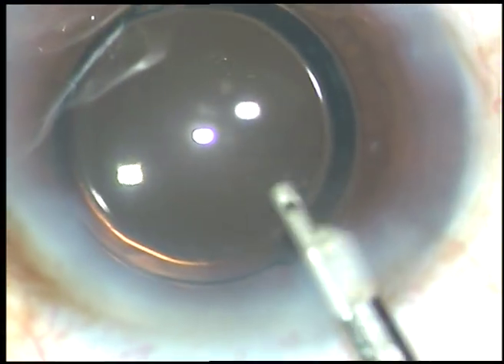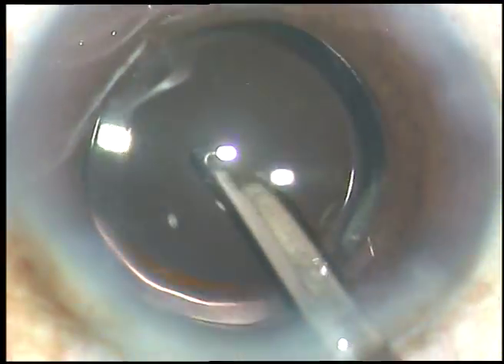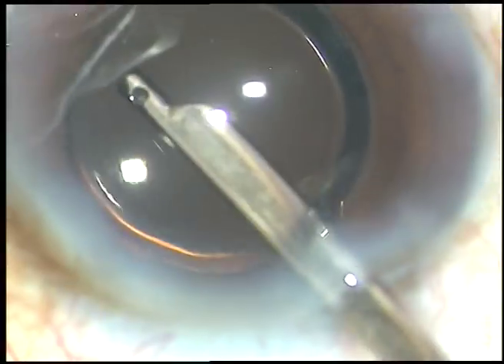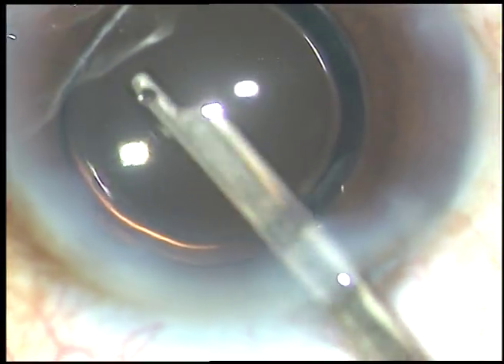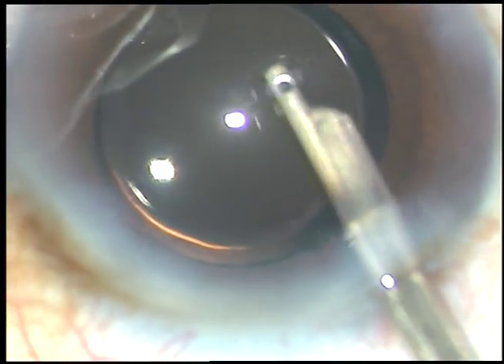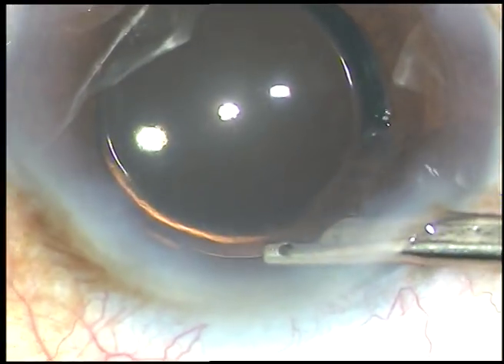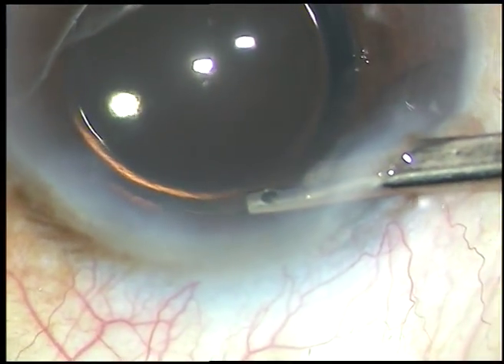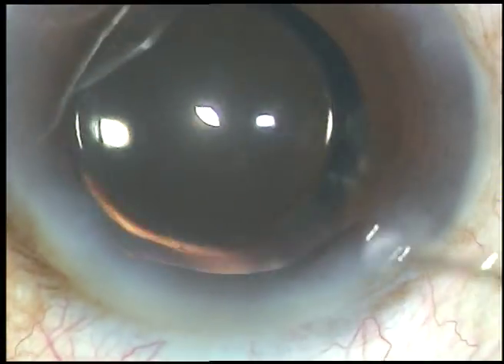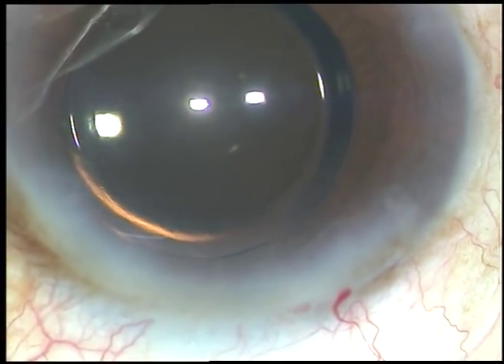This is the final lavage of the anterior chamber. The viscoelastic substance that sticks to the corneal endothelium comes out at this time. And whatever I have used — pilocarpine, moxifloxacin — I wash it out at the end. Thank you very much for watching. Hope this video will give you a lot of tips to improve your surgical skills.